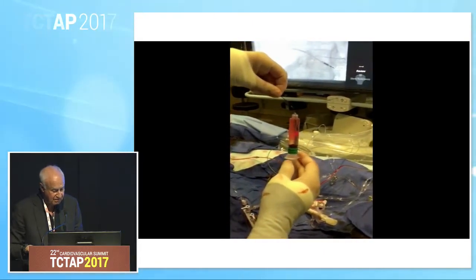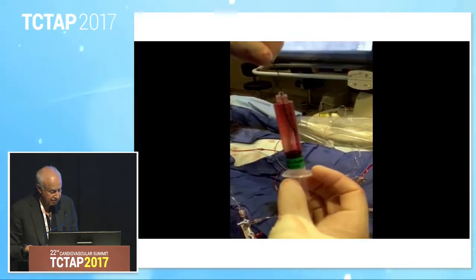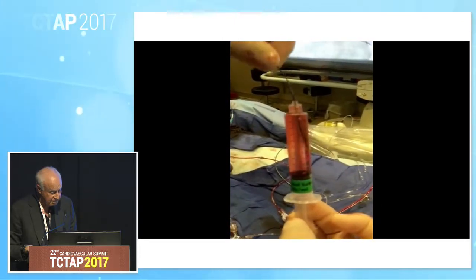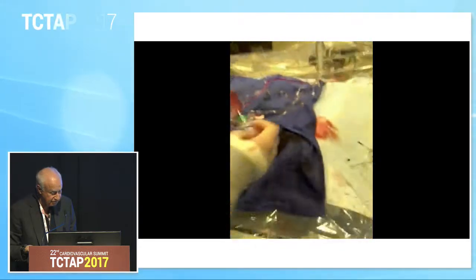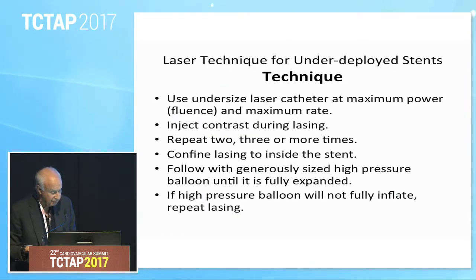This is to demonstrate the cavitation that you get when you first use it. In the first picture we had saline in the syringe, and in this picture we have contrast. And the sound is quite different. You see the formation of bubbles in a syringe, and these bubbles you can also see inside an artery if you laser in using contrast.